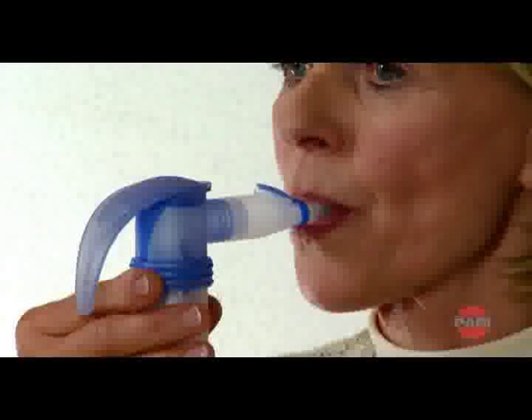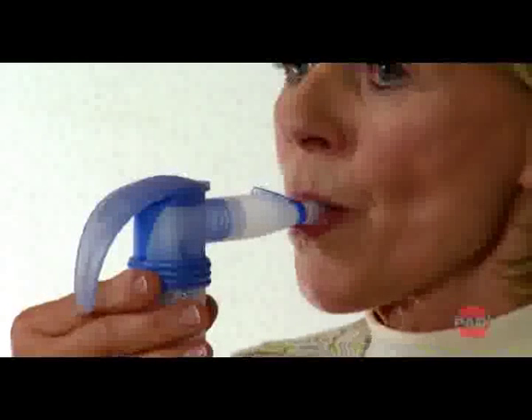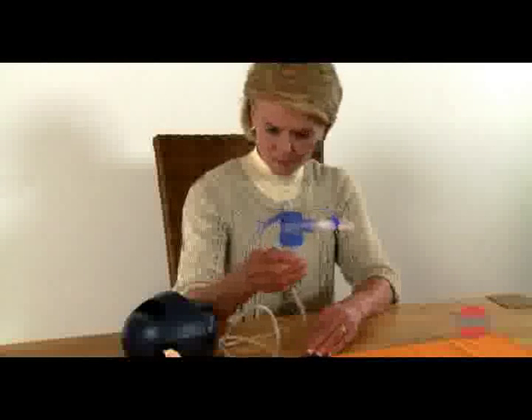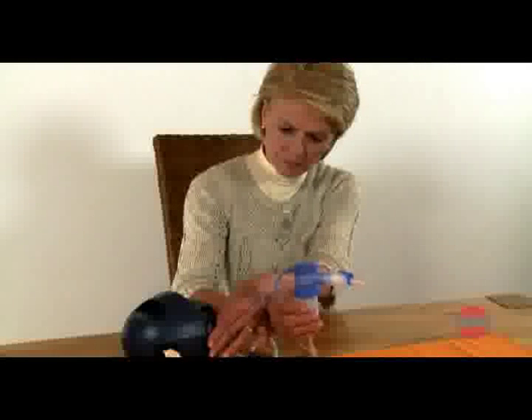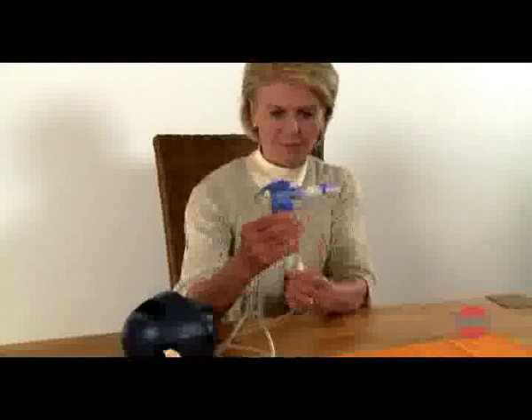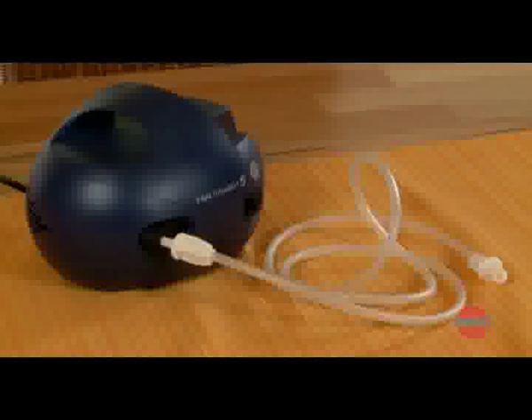Keep inhaling until the noise made by the nebulizer changes, indicating that the inhalation session is complete. Then check whether a clearly visible aerosol is still flowing from the nebulizer. Stop treatment as soon as the aerosol emerges intermittently. Disconnect the nebulizer from the connection tubing. Any moisture that appears in the connection tubing can be dried by using the compressor to blow air through the tubing for a few minutes.